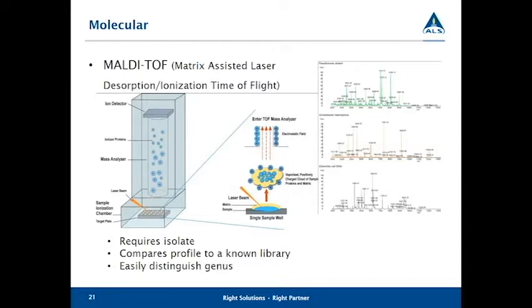Well, in this case, you actually have to grow and cultivate the organism and isolate a colony. So you would only have live organisms to put on this instrument. All the pre-cultural steps in order to get it to a single colony on a plate have to be performed ahead of time in order to be able to use this to identify whether it's E. coli or Salmonella or Listeria. So it would only be able to detect live organisms. Thank you.